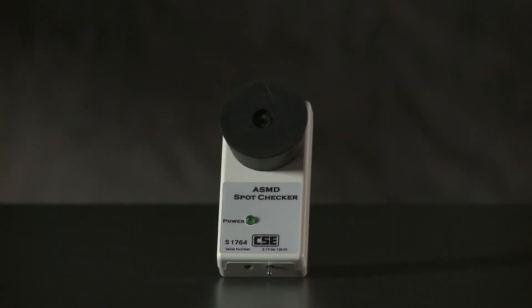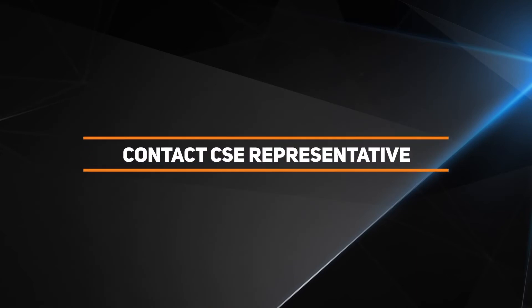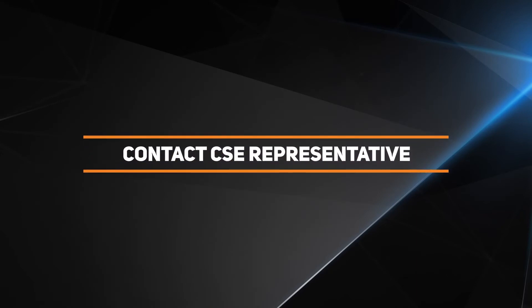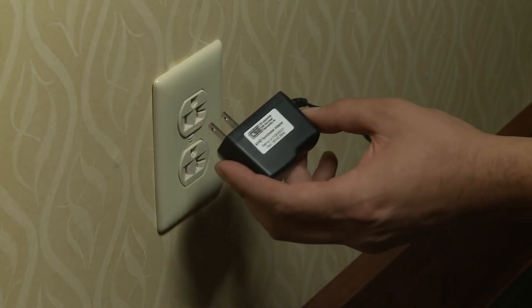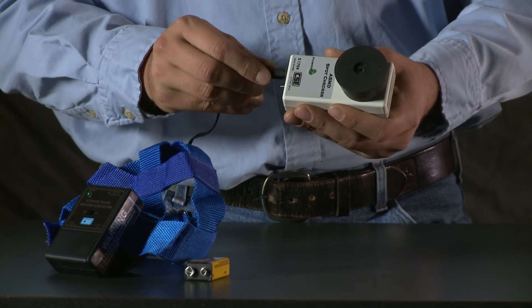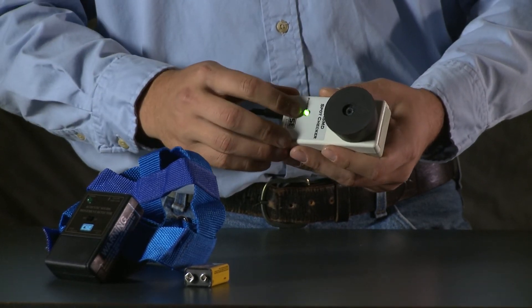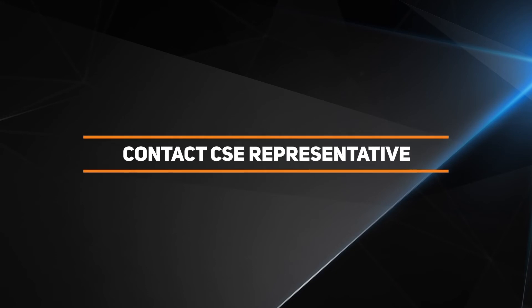First, check the calibration date sticker. Your Spot Checker should have been calibrated no more than six months ago. If the calibration date sticker is missing or not current, don't use the Spot Checker — contact your CSE representative or send the Spot Checker back to CSE for calibration. If the calibration sticker is current, power up the Spot Checker: plug its power adapter into a 120-volt outlet, connect the power adapter cable to the socket in the Spot Checker's base, and flip the power switch to ON. The green power light will glow and the Spot Checker will emit a high-pitched tone. If the power light does not glow, check the connections. If the Spot Checker still does not respond, don't use it — contact your CSE representative and ask for repairs or a replacement.